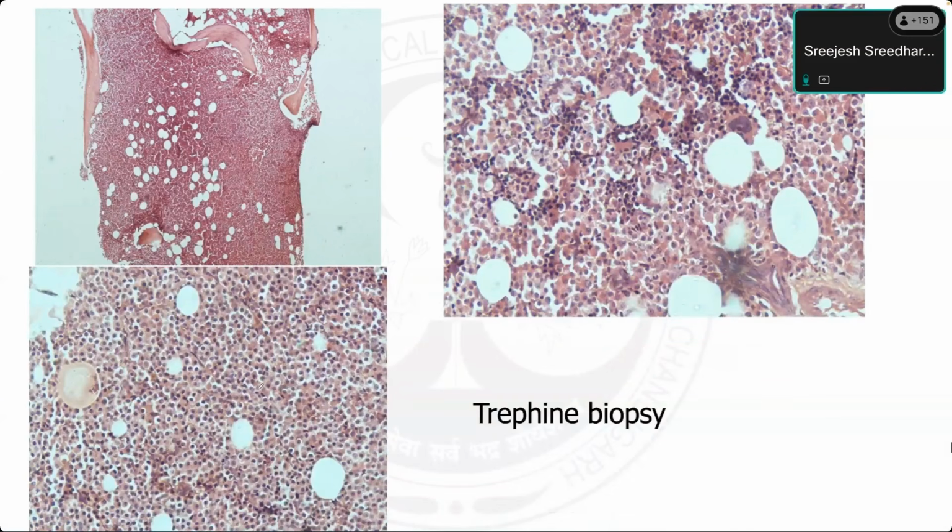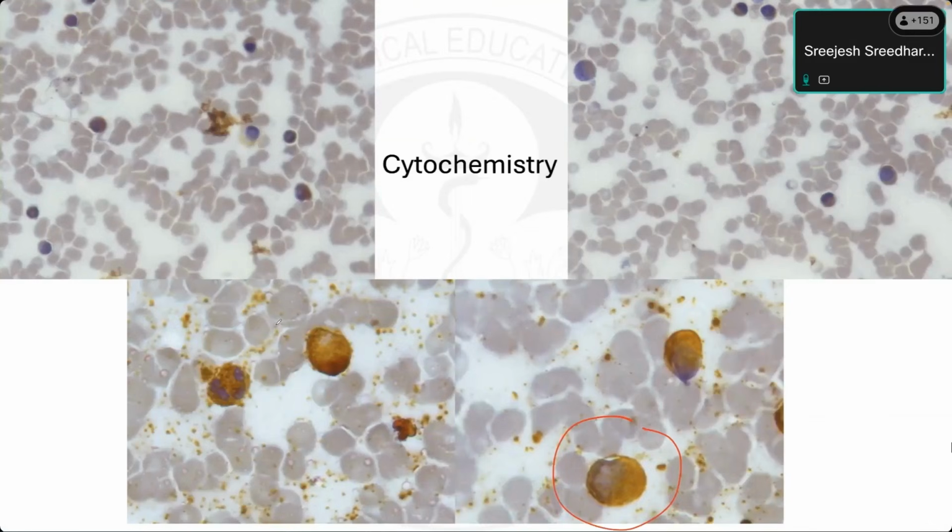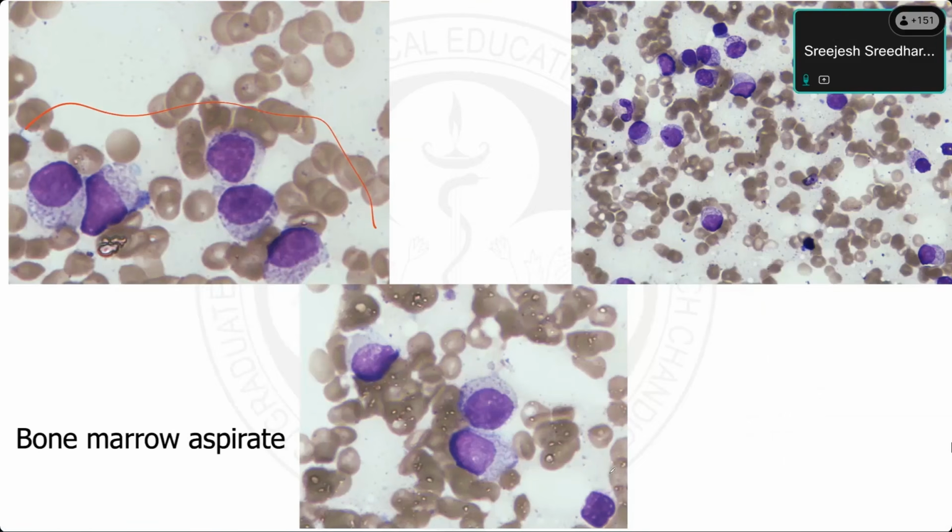You see this, it may be confused with a multiple myeloma, right? They had very eosinophilic cytoplasm, a very regular nucleus, and an eccentrically placed nucleus. If I see only this biopsy, I might confuse it with a plasma cell myeloma, but APML is another entity which can have this kind of morphology. So this is the biopsy. Though the morphology was not classical of an APML, the features were highly suspicious of an APML.